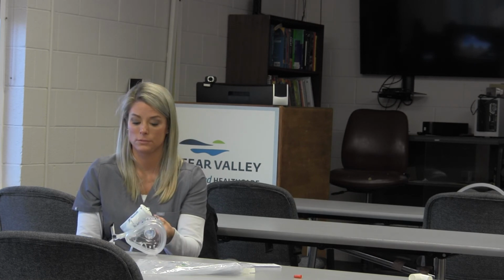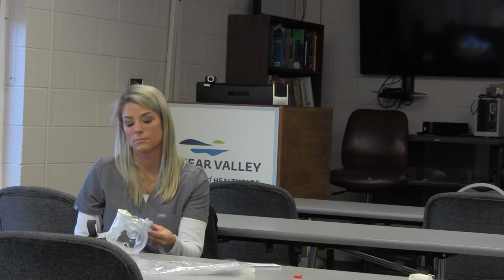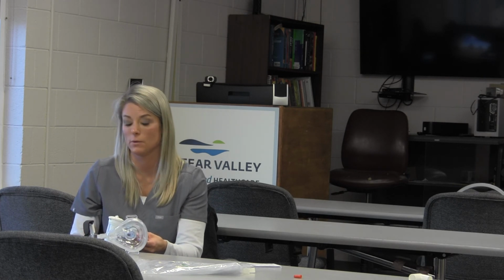You can touch it, we will adjust that. Once you set it on CPAP and it's working well and you move them to IPAP, then you may have to adjust this so it's appropriate. Okay. So then you would adjust it so that it stays the same reading once it's in the BiPAP phase, right? Yeah. But you want to look at the manometer to get a visual of the reading too, so that's kind of why you have that.